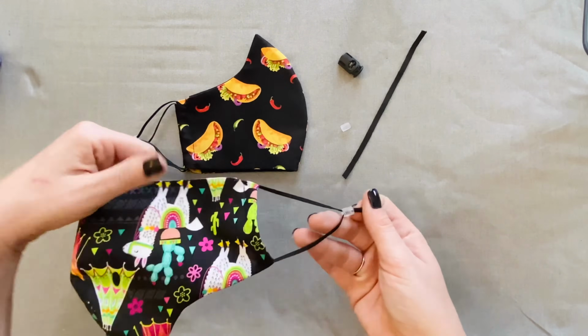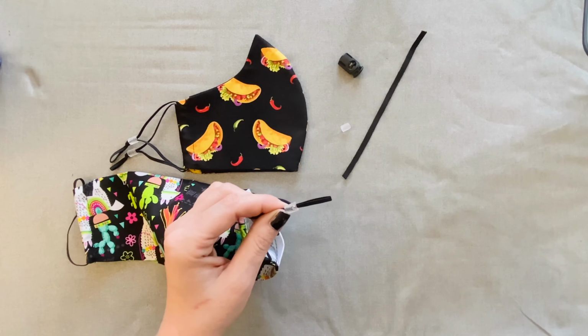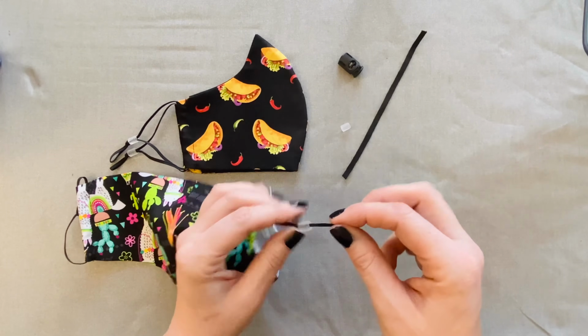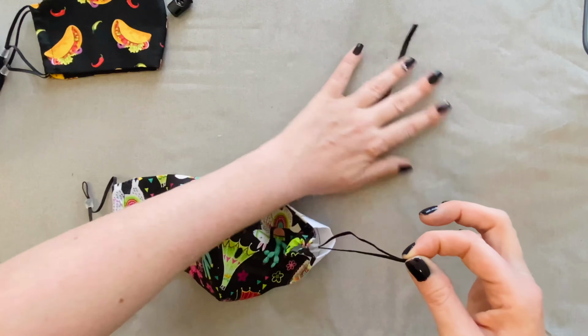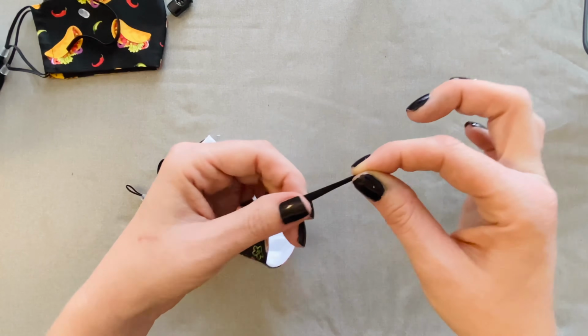Now, the other thing that you might be worried about is these are very small. So if you have a smaller child, you could be worried it's a choking hazard, or just the fact it might come off and you might lose it. So what I'd recommend is pushing all the way to the end. Push this to the side so we have a nice clear view. I'm pushing it all the way to the end.